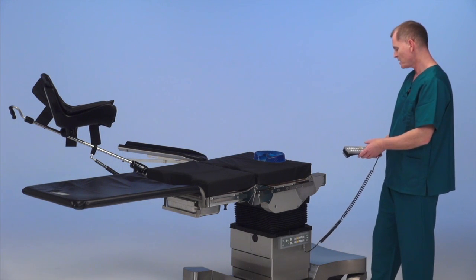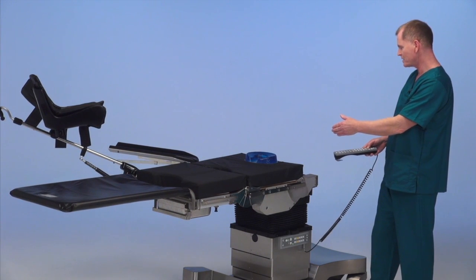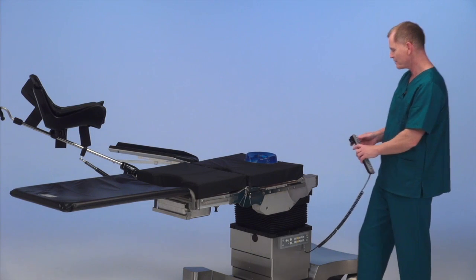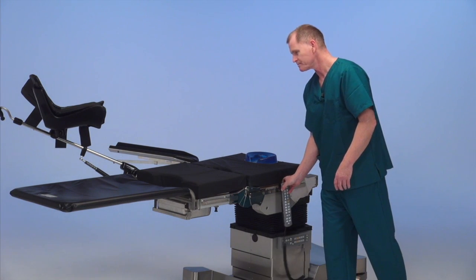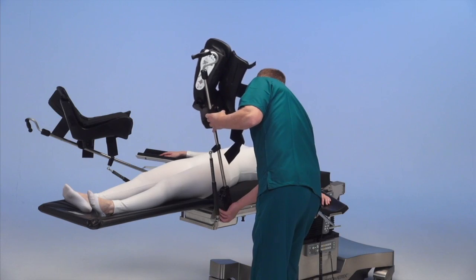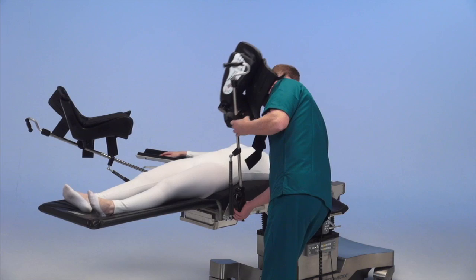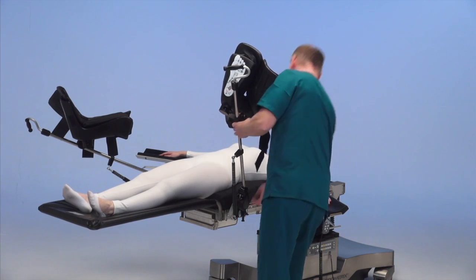When it reaches the first slide, that's the GYN cut; the second slide is the urology. We've placed the second armboard on the table. After we transfer the patient, legs are on the lightweight transfer board on the table.